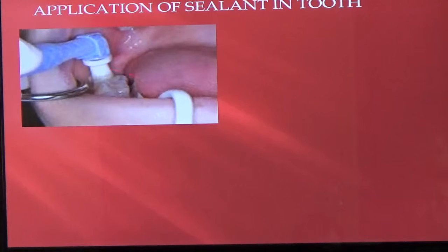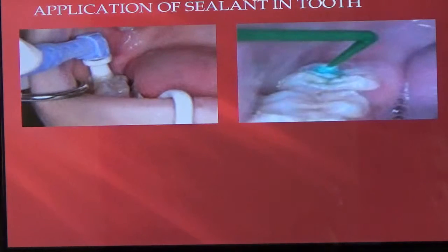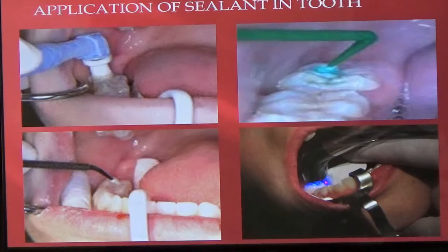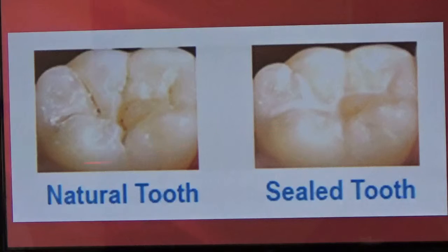Okay, so here's the procedure. You've got isolation here, retraction. You've got your saliva ejector kind of bent down and underneath the tongue. Your pumice with the flour of pumice, the gray pumice. You etch with an applicator tip for about 15 or 20 seconds. You rinse and dry, and you apply your sealant with an applicator or the little syringe that we'll show you. Then you hit it with a light, again 2 millimeters above this tooth.